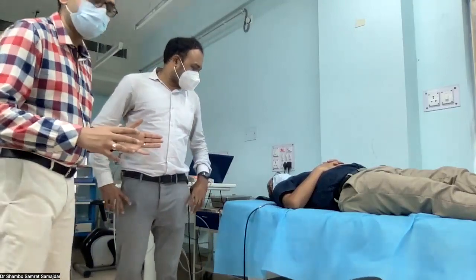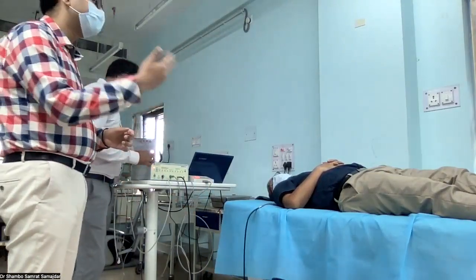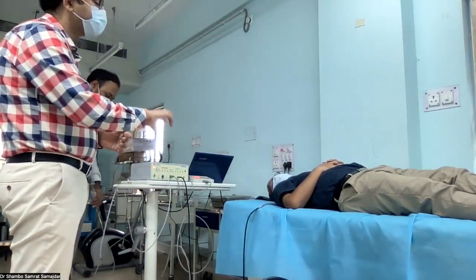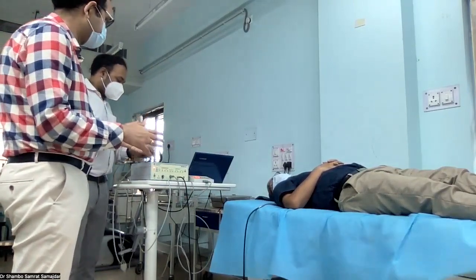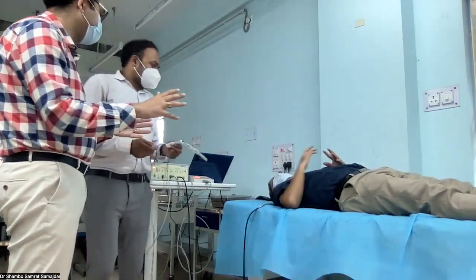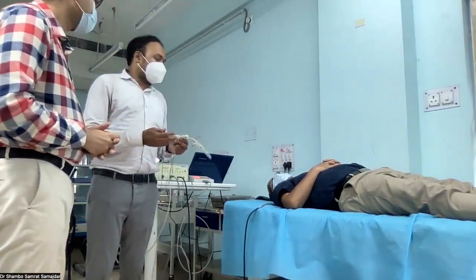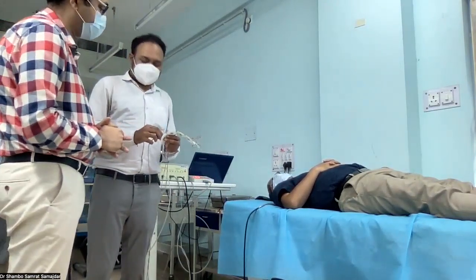Another important thing while we are telling our patient to lie down: the patient should not smoke at least 3 to 4 hours before the procedure, and we need to ask whether the bladder and bowel have been cleared or not. The patient shouldn't take anything containing caffeine. Let's start.